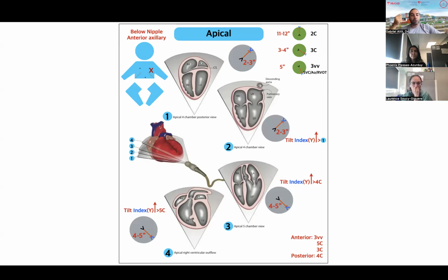So cardiologists, when they're doing structural echo, will investigate and probe the septum in every single view to make sure they don't miss any of the VSDs: inlet, outlet, perimembranous, or muscular VSDs. Or the last one, which is sometimes classified as a VSD but is not a VSD, is an LV to RA shunt, a Gerbode defect, which is not technically a ventricular septal defect because it's not between two ventricles, although many will classify it as a ventricular septal defect because one of the holes is part of the ventricle.